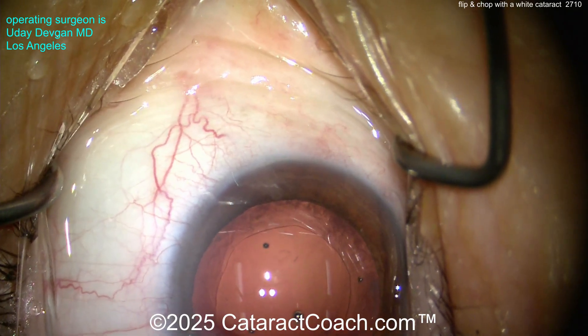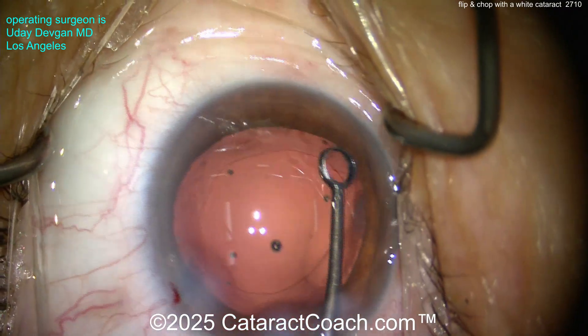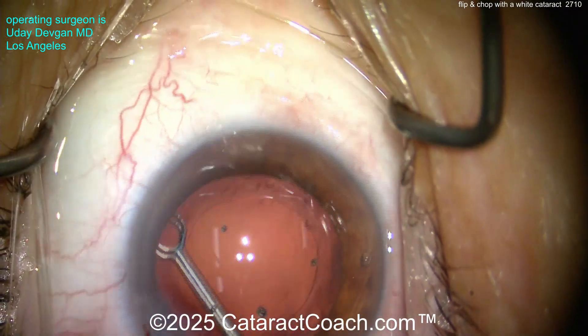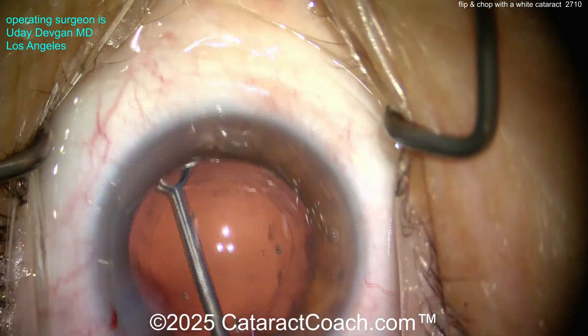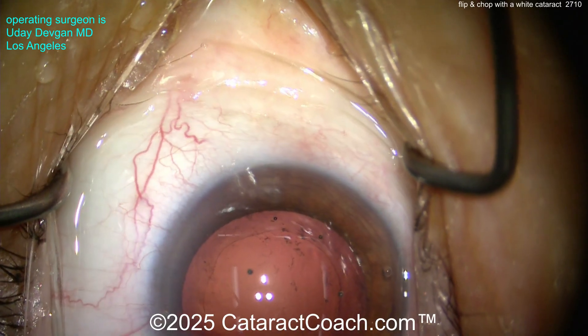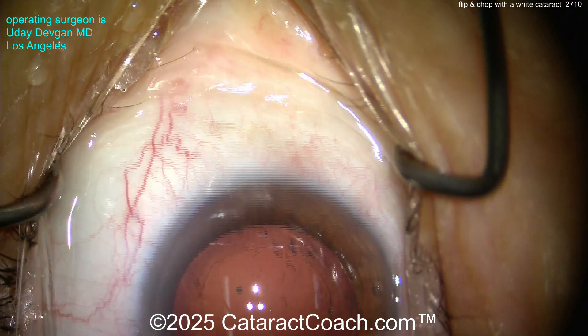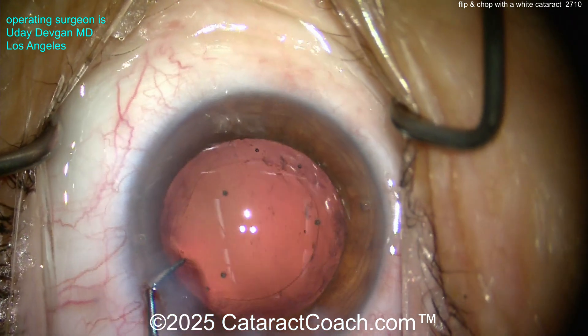The big advantage of flip and chop is that we're operating way above the capsular bag. Another advantage is we can access the dense posterior plate — the thickened, leathery posterior plate of the nucleus. And third, it's actually less stress on the zonular apparatus since we're not fully operating inside the bag. We're partially in the bag, so it's a fantastic technique.